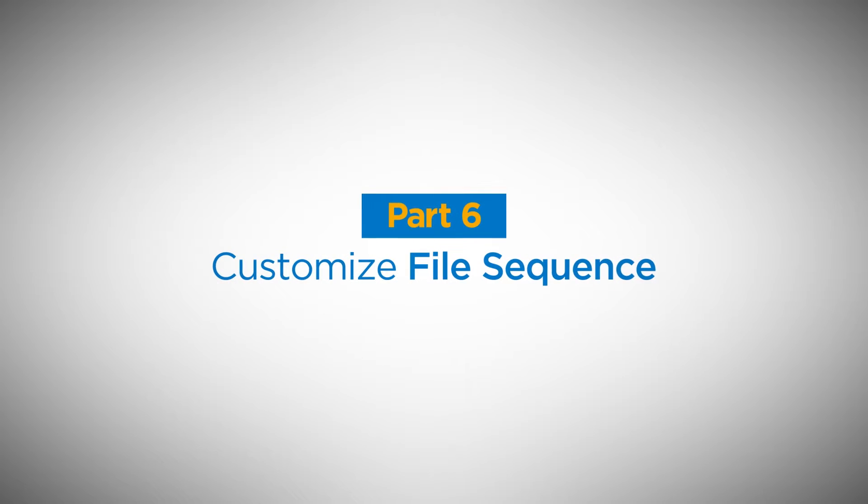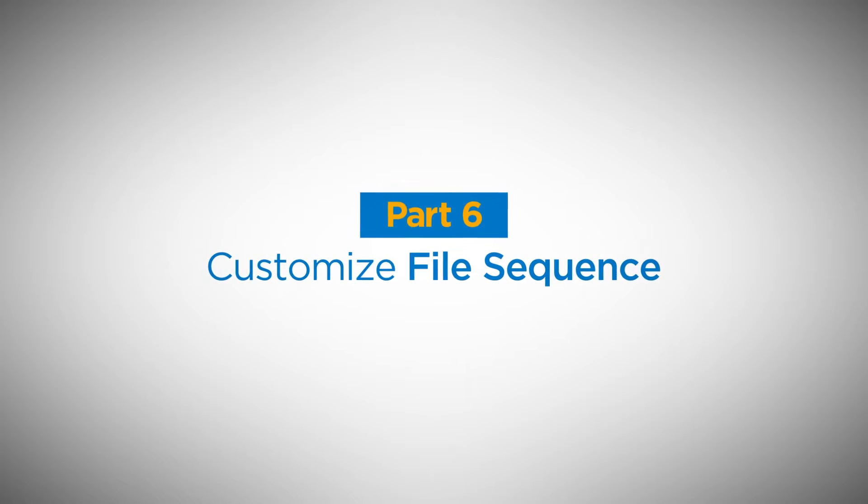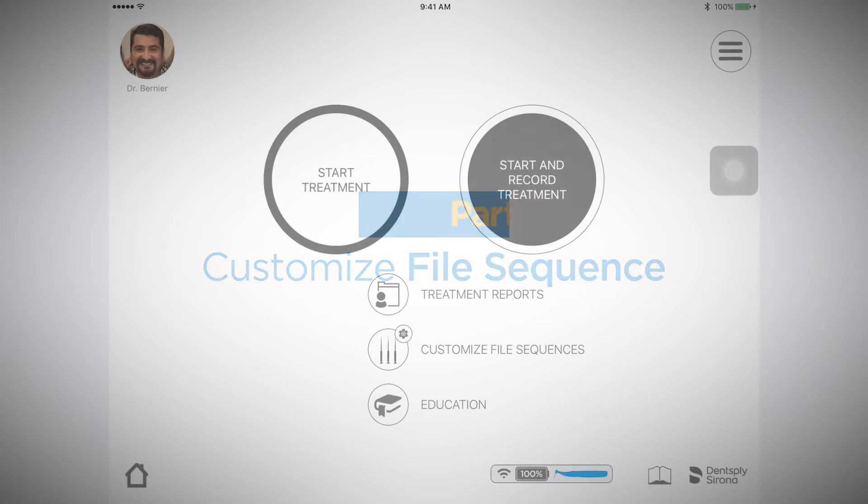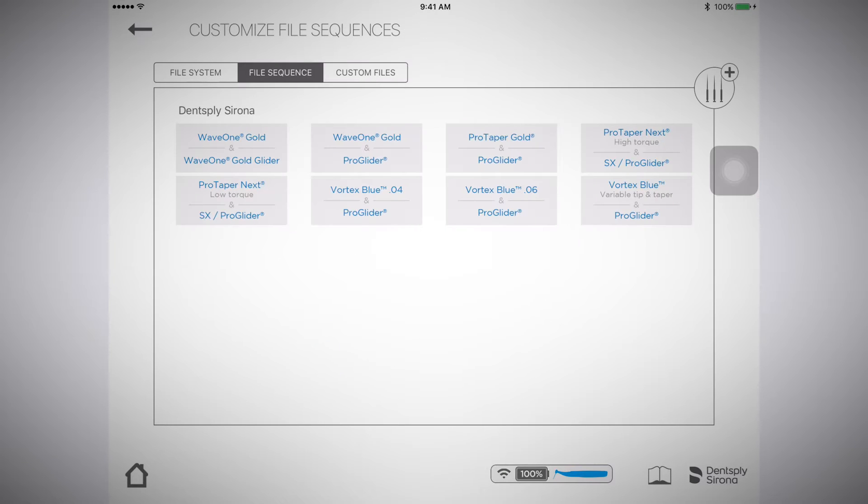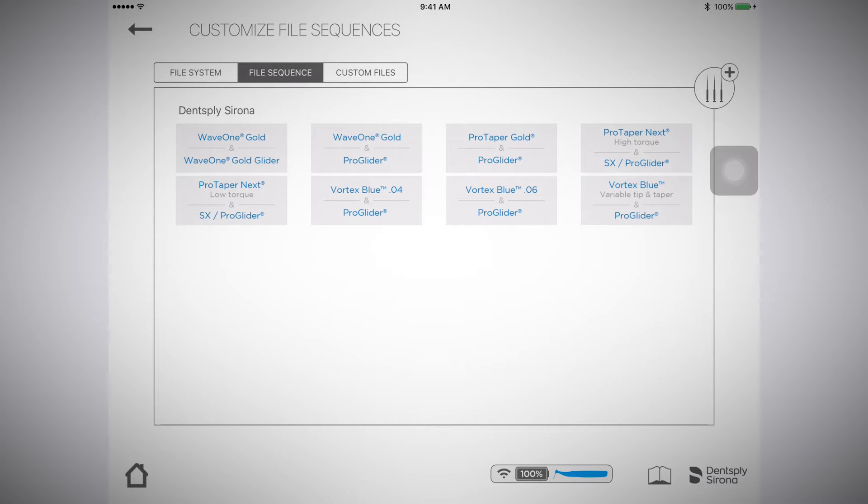Customize file sequence. On the EndoIQ app homepage, you'll find custom file sequences. In this section, there are preset file systems and sequences from Dentsply Sirona Endodontics.